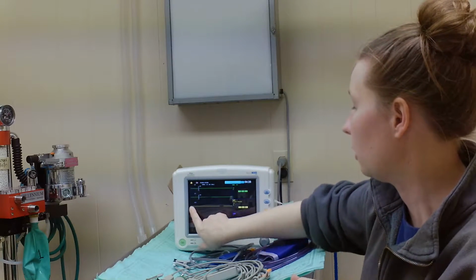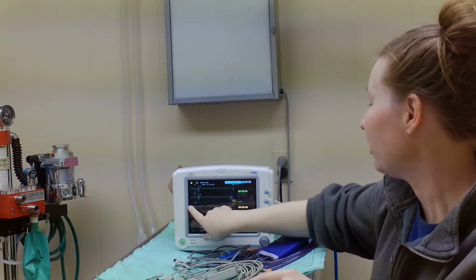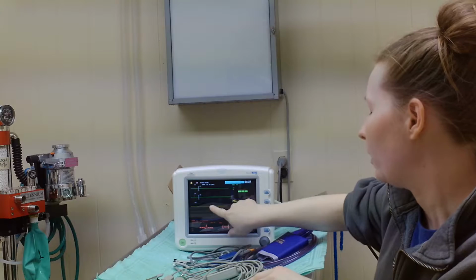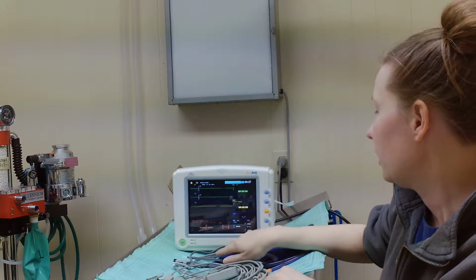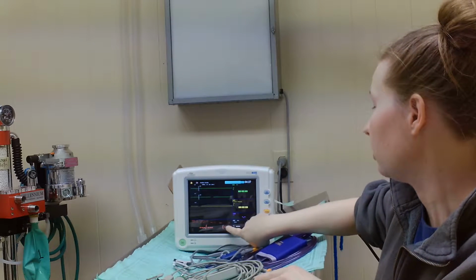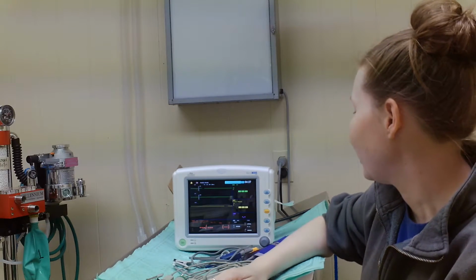This yellow is our pulse oximeter, or saturated oxygen, the oxygen-saturated hemoglobin, right here. It also monitors respiratory rate, as well as a little bit of heart rate, to an extent. It'll give a normal wave throughout here, and that number will come up right here. And then the NIBP, which is non-invasive blood pressure, will give you your systolic and diastolic number readings right here, and then it'll give you your average right about here. And then CO2, if we had a capnograph or end-tidal carbon dioxide output, would be right about here. But like I said, we didn't have a capnograph today.